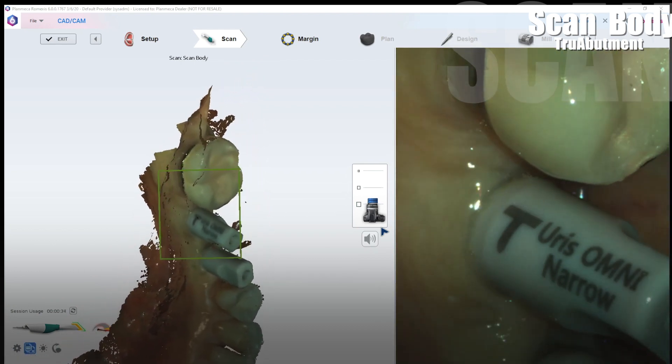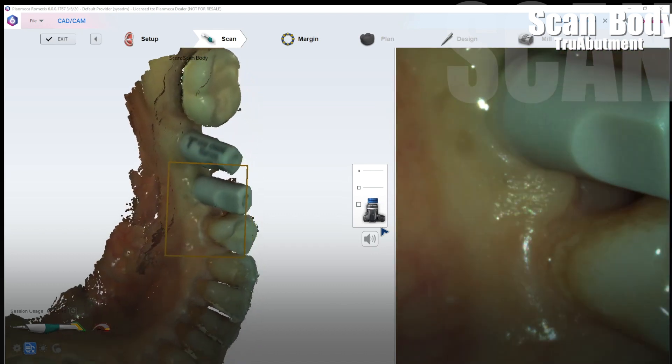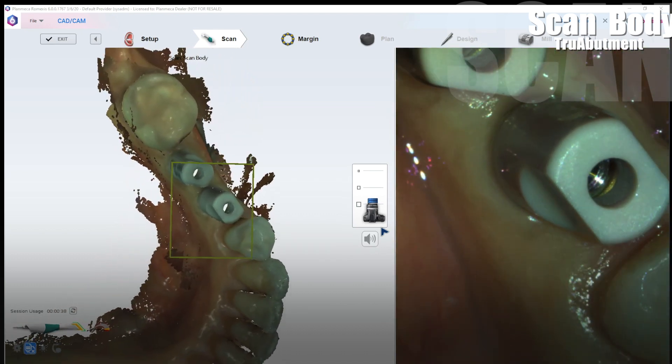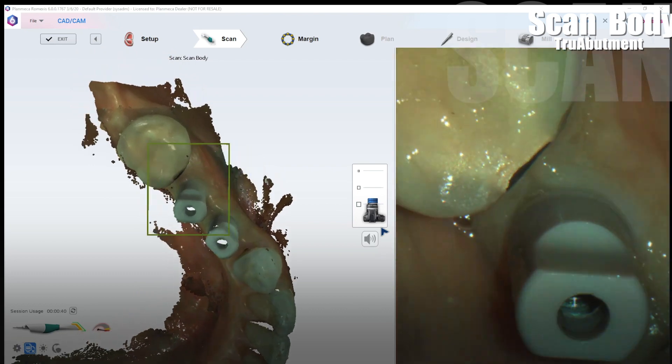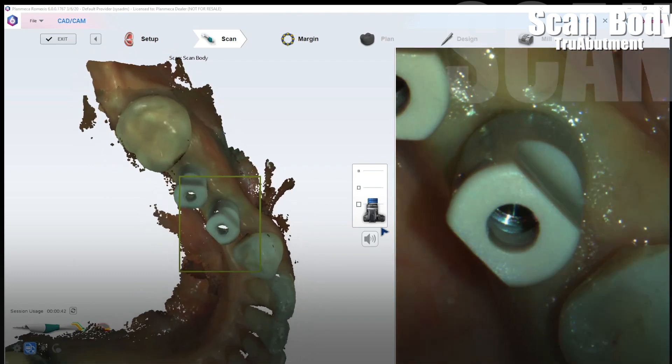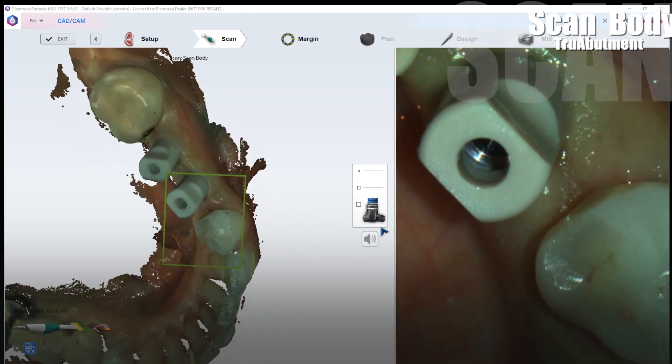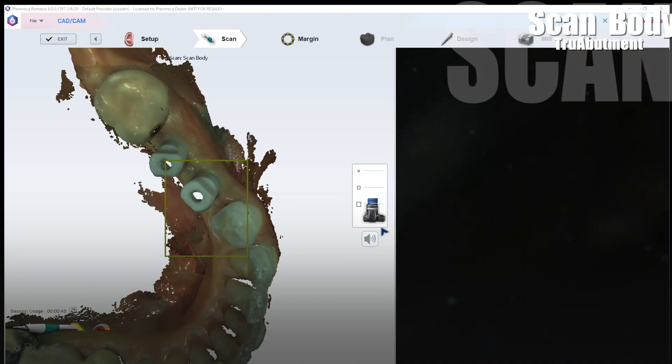So now I turned on active delete and you can see it deleted everything else, kept the scan bodies, it deleted the cheeks, lip and tongue that I accidentally scanned in and preserved the scan bodies.